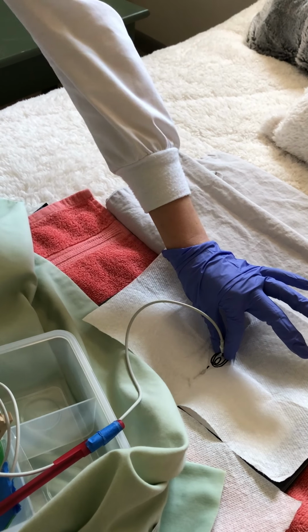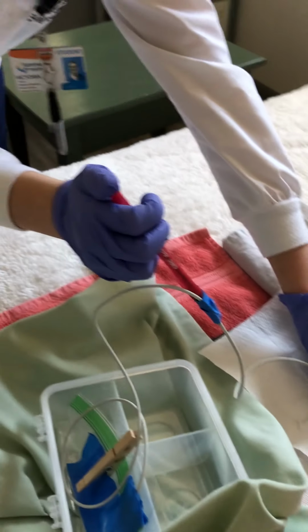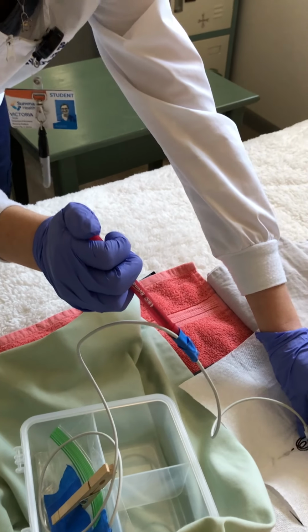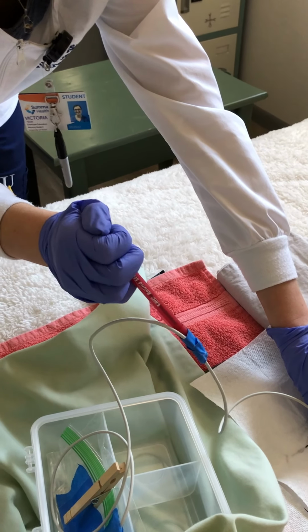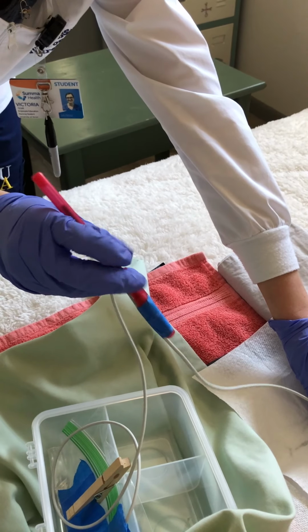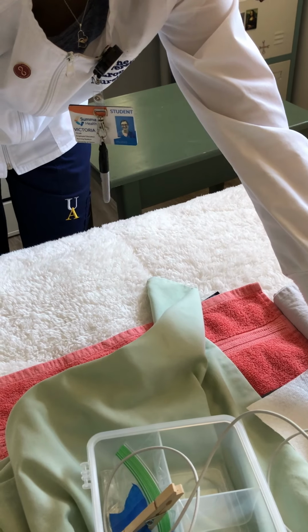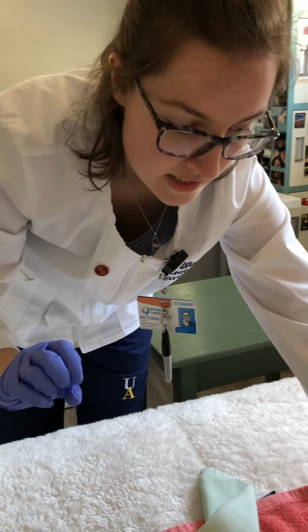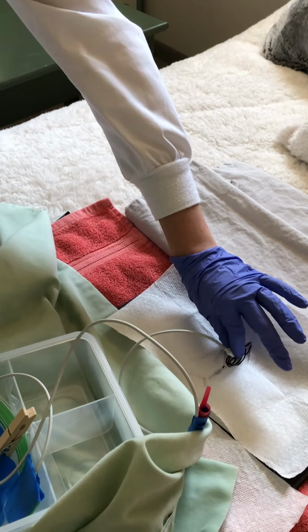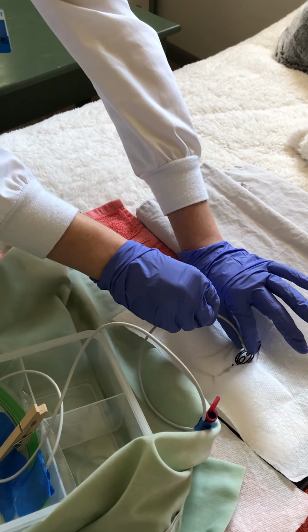So with my non-dominant hand, I'm going to hold that catheter in place, and I'm going to inflate the balloon using the entire saline solution. Once I have done that, I'm just going to discard of that. I'm going to put this in the sharps container, okay? All right, and then I'm just going to tug and feel for resistance, so make sure that balloon's inflated.